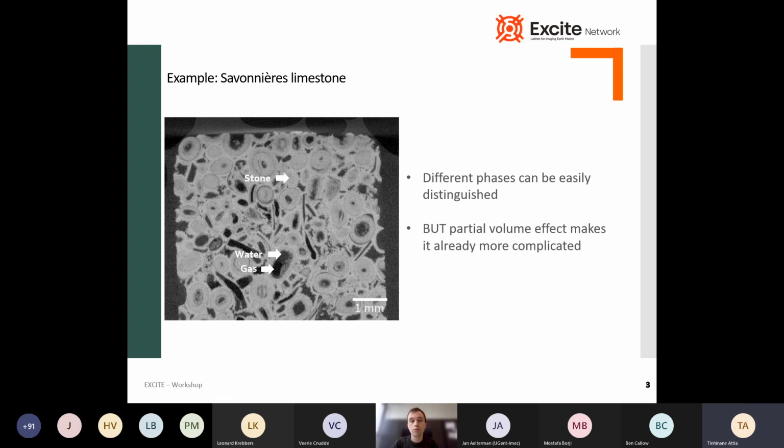But I want to also point out that even here, there are already some complications. As you see, within the stone, there are different gray values, and this is not related to any kind of different composition. This is related to the partial volume effect, as there are micropores present, which also change the gray value a bit.